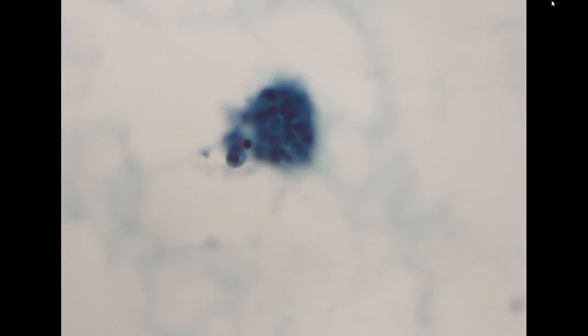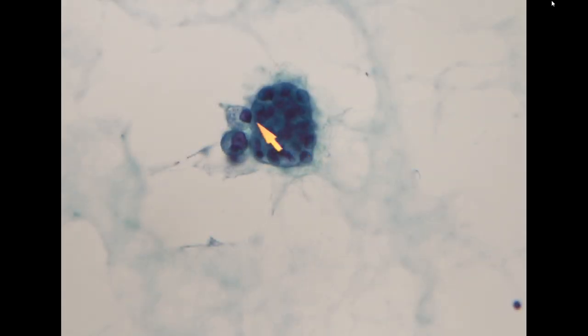adenocarcinoma. And again, here we see another cluster. This is very three-dimensional, so you need to focus up and down to see through. Again, you see the eccentric nucleus, bubbly cytoplasm with pleomorphism, as well as prominent nucleolus. So this is compatible with gastric cancer with abdominal cavity involvement.